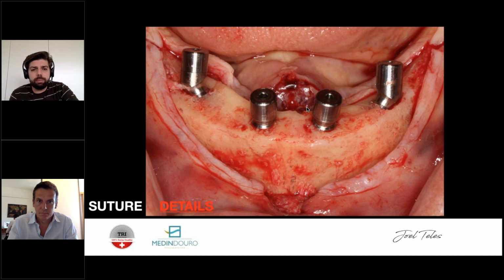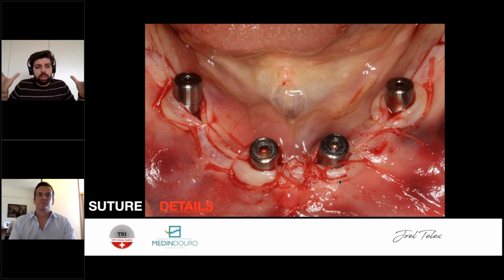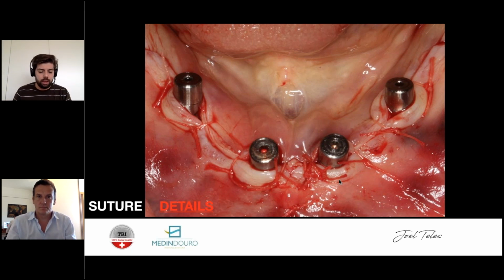Sutures. People asked me because they didn't understand quite so well what I did here. So two things first. The intention is that you get it stress-free, this keratinized tissue here, especially in the lower jaw. The keratinized tissue is normally a very small amount in the lower jaw. You put it around your multi-units, and you want it to stay there. If the muscles are doing pressure over there, it will come down, and you'll end up grafting to try to regain keratinized tissue. So think in advance.